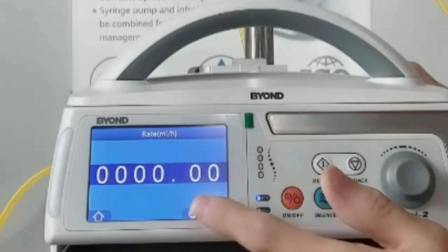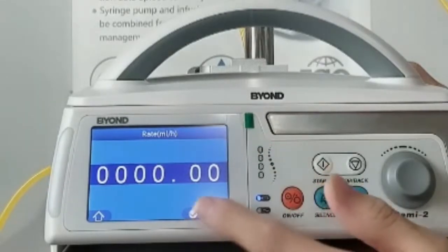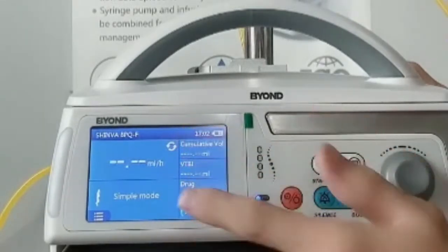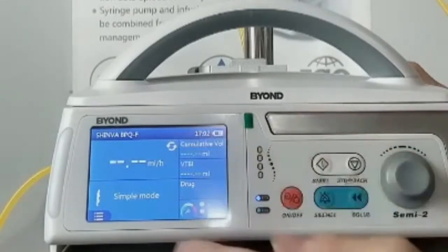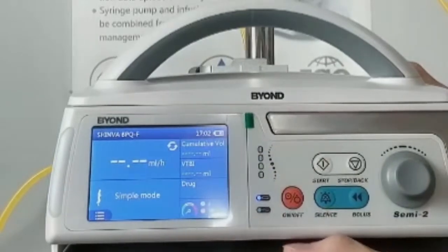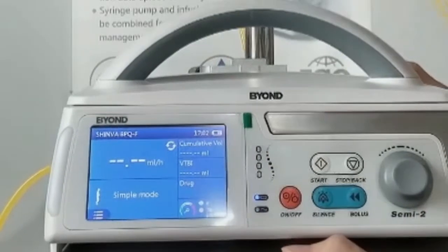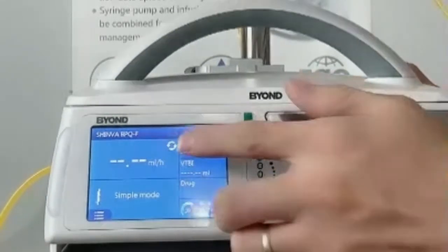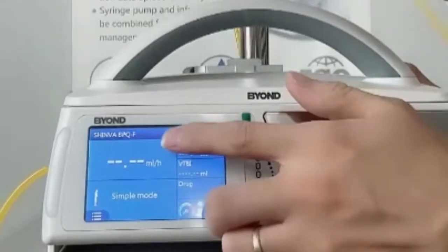This is the rate. You can change from milliliter per hour to drop per minutes for the units here.